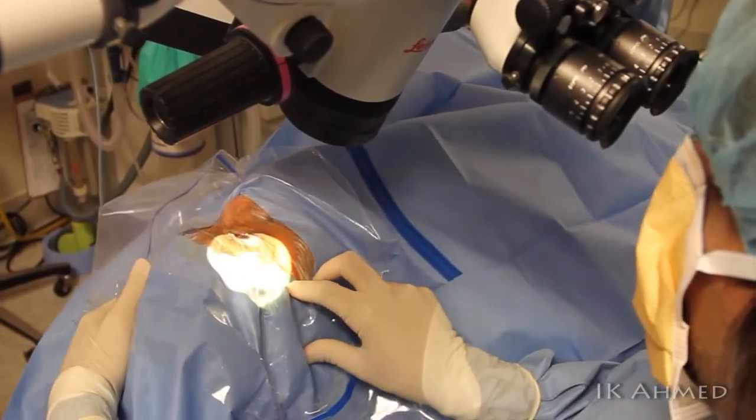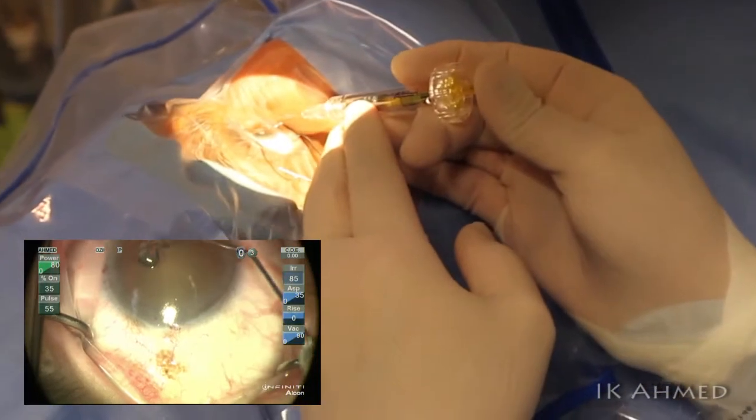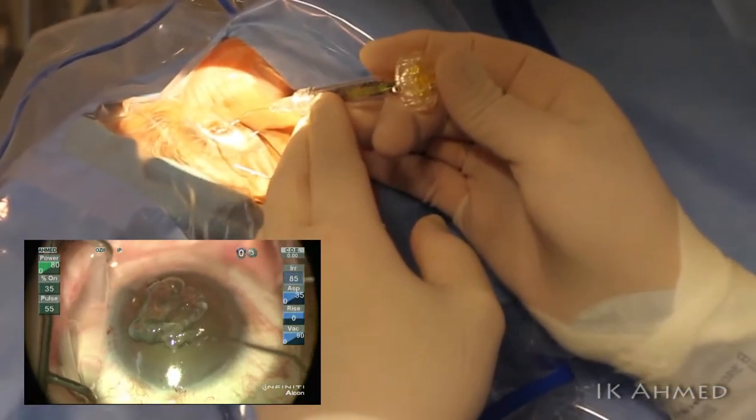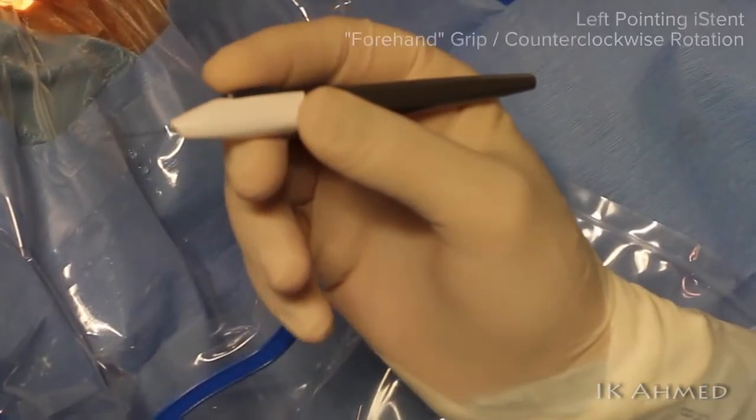This is the standard gonioscopic approach to surgical viewing of the angle. A coupling agent is applied to the surface of the cornea that will allow the gonioprism to sit nicely on the surface.